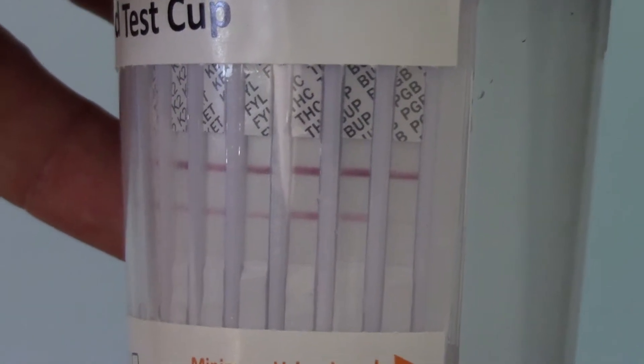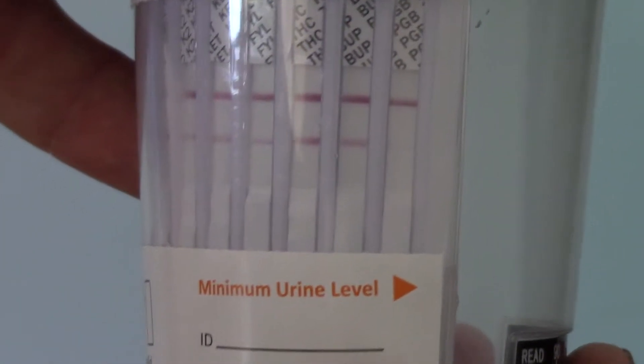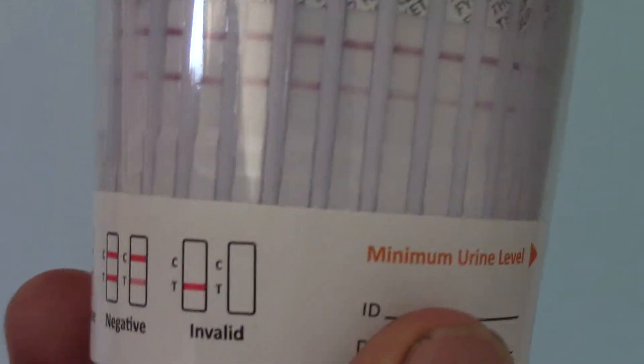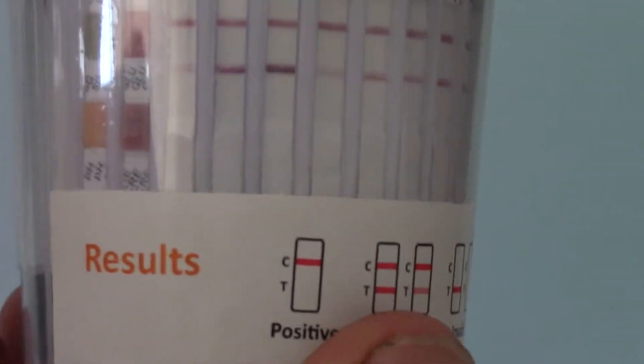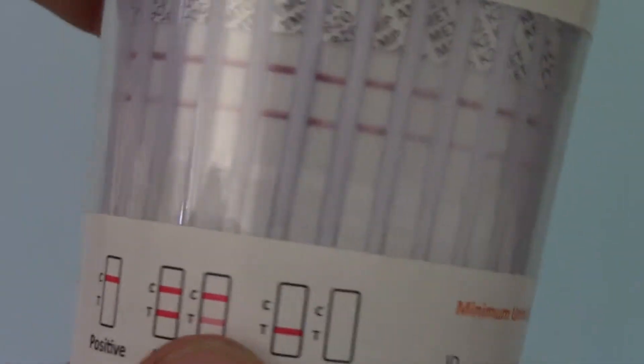So although that line is extremely faint for pre-gabalin, this is a negative test result. And the sample here is clear for all 16 drug groups tested.